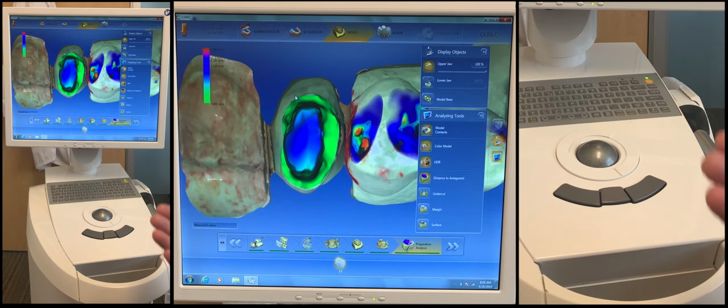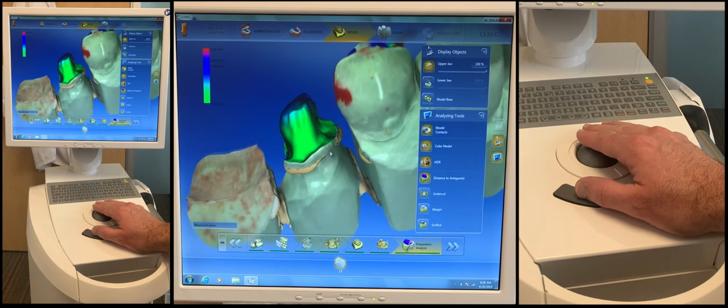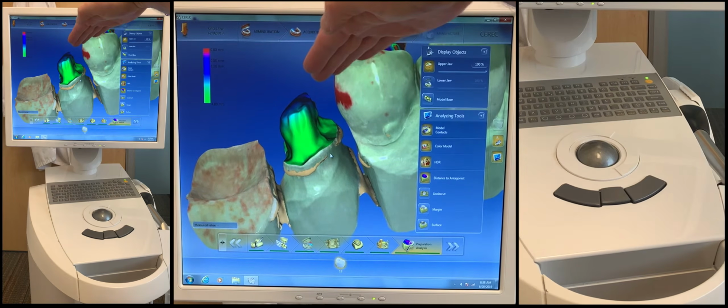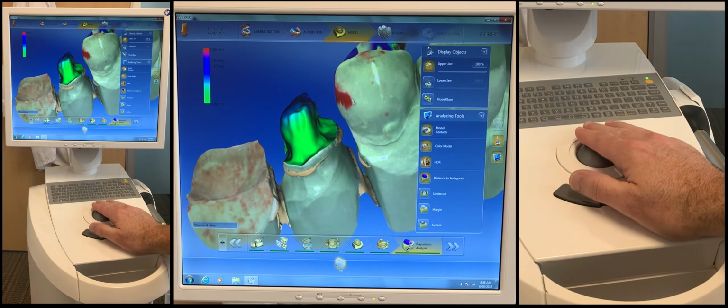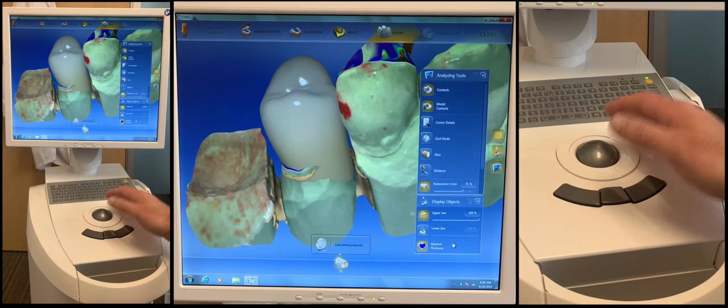So be cautious. There's a difference between removing tooth structure and actually reducing the tooth to create appropriate reduction. We don't want to just drill till there's a gap that we think is enough. Oftentimes you have to measure that, and sometimes you have to get real specific to make sure we have appropriate reduction off the occlusal in particular to facilitate a good long-term restoration. Okay, so we're going to go ahead and go to the next step.